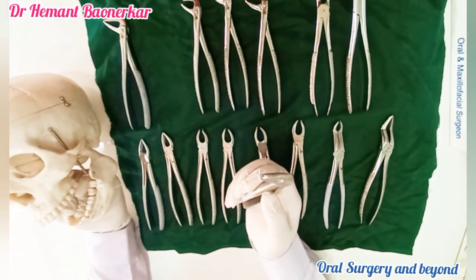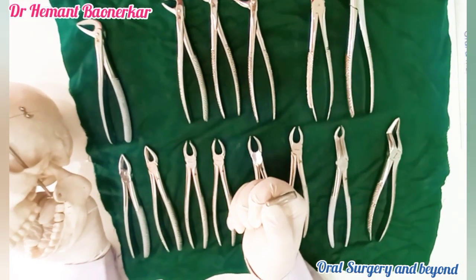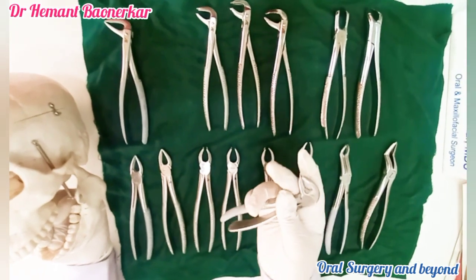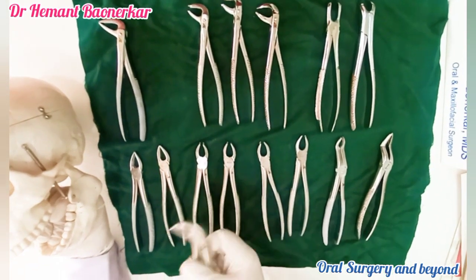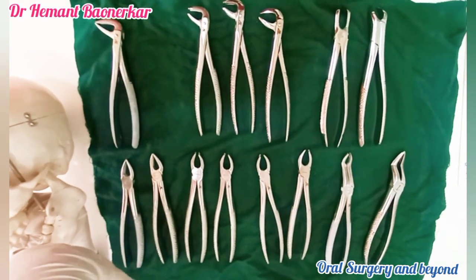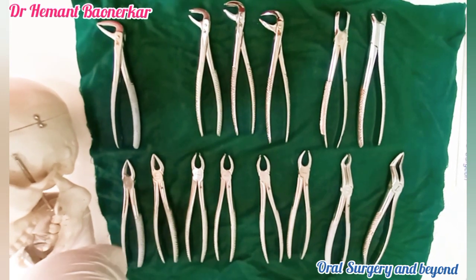This is the mandibular premolar forceps. As I said earlier, the mandibular premolar forceps always has a small gap between the beaks. This will engage the premolar like this, and we can take it out.